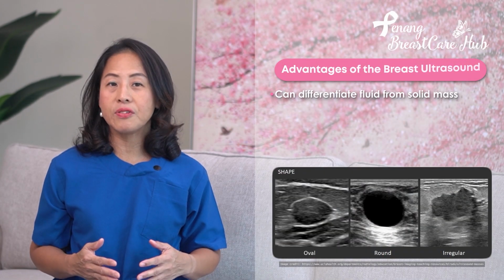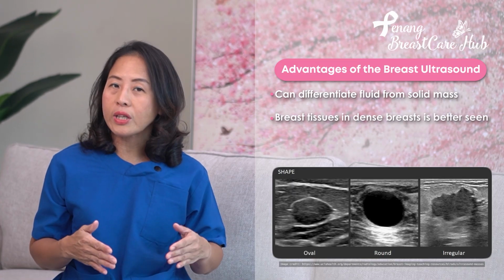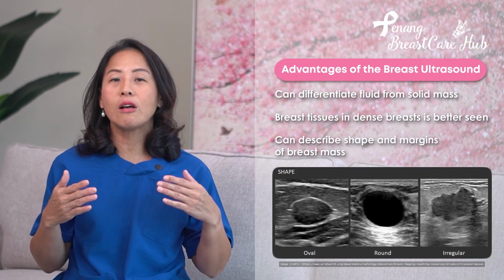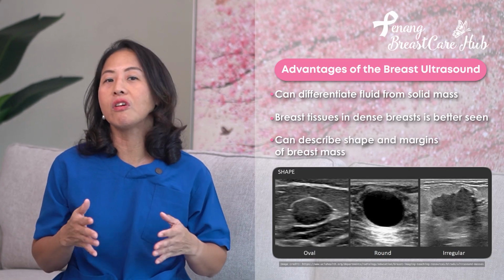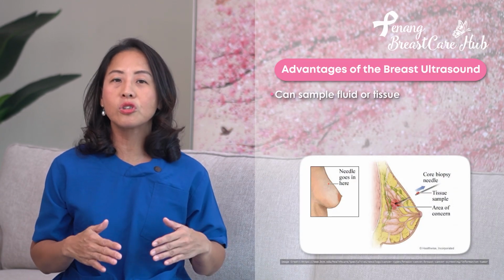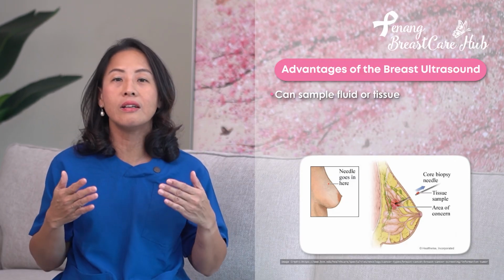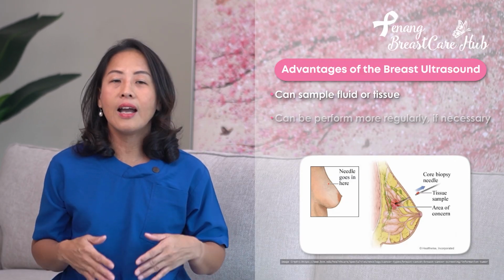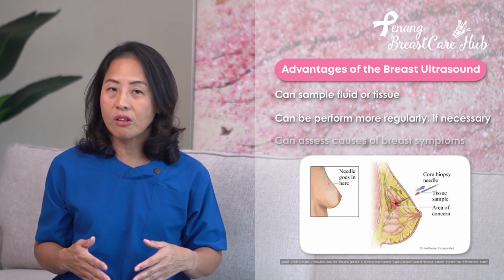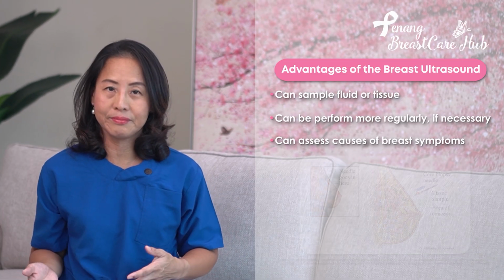Breast ultrasound can differentiate cystic fluid from solid masses in the breast. Breast tissue can also be better seen in mammographically dense breasts. Breast ultrasound can delineate the shape and margins of the breast mass to differentiate between benign and malignant lesions. They can also be used to obtain fluid or tissue samples from the breast mass via ultrasound-guided biopsy, and they can also be performed more regularly if necessary. Breast ultrasound can evaluate the cause of general breast symptoms like swelling or breast pain.